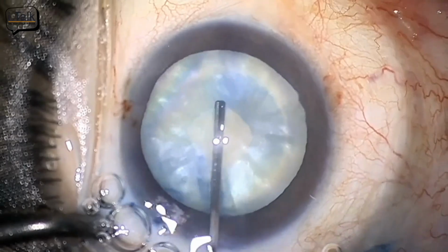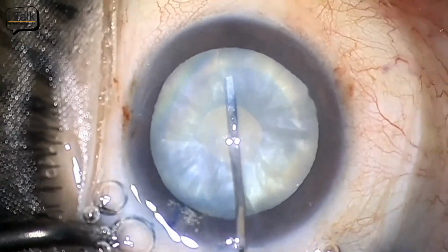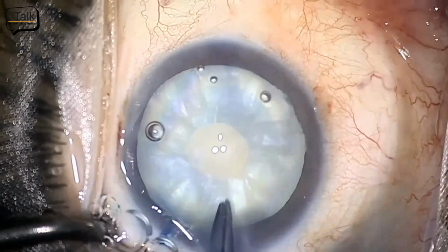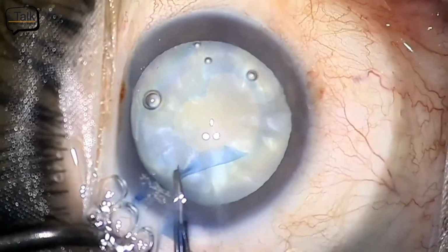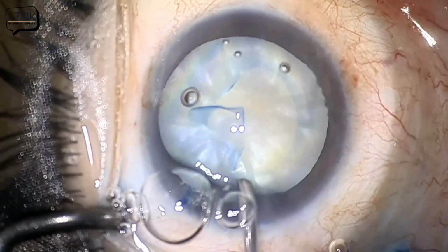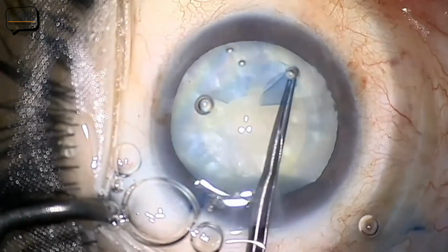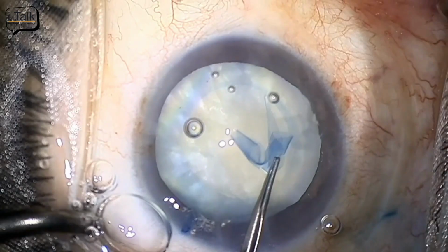Milking it, I'm pushing the high pressure intralenticular cortex from the periphery to the center. And I gave a nudge also, if you saw. So that nudge which I gave created a situation where the posterior cortex from the posterior compartment was brought forward.